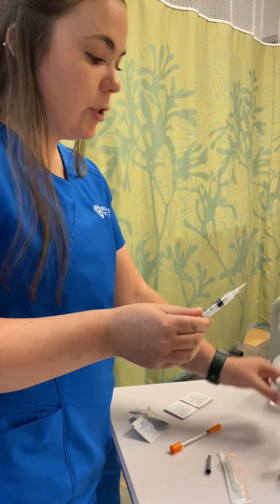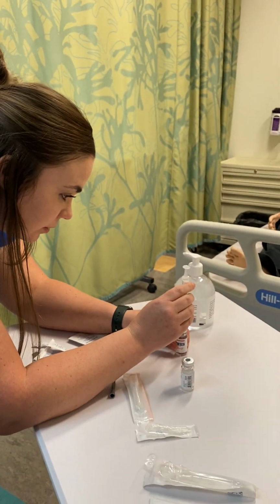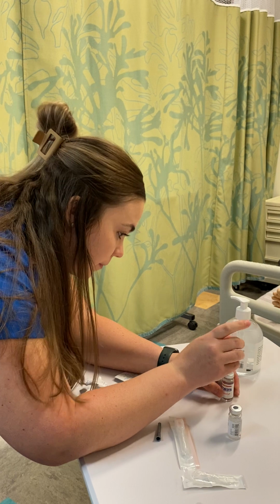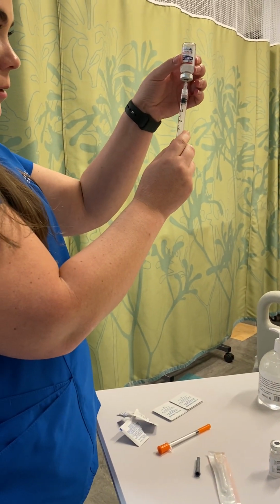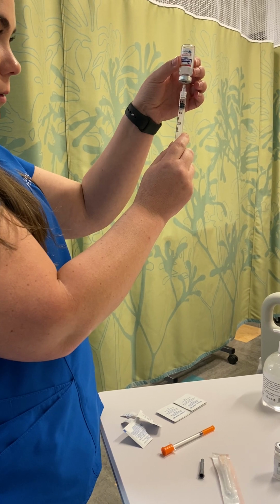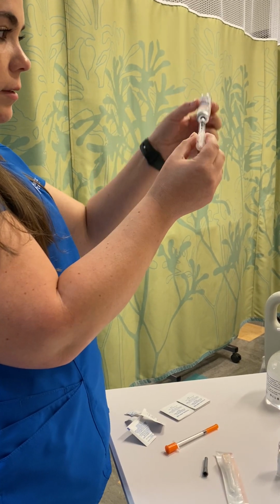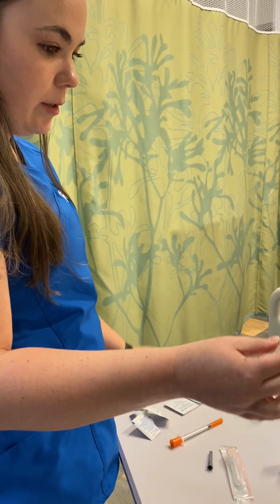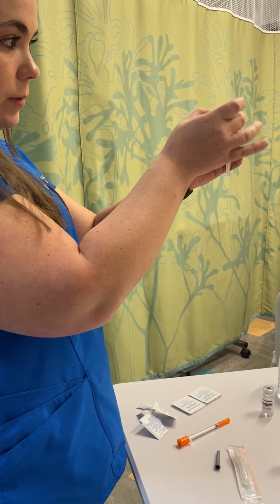And then I would make sure that this is flat on the table, and I would insert the air above the solution. I would turn it upside down. I would draw back the correct amount, plus a little bit extra just in case there's air in there. Pull it out, put this back on the table, and I would flick to make sure that there's no air bubbles.